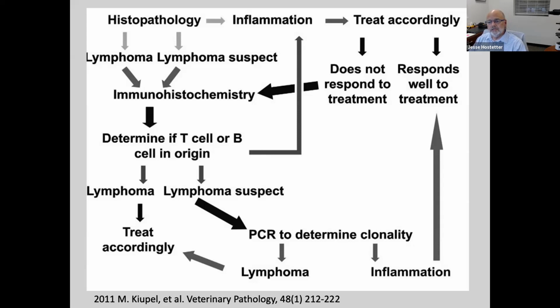And David asks, does feline lamina propria fibrosis have a correlation with disease? David, I think you're talking about something I danced around and haven't talked about, that funny eosinophilic change that's kind of a linear pattern in the mucosa of some cats.